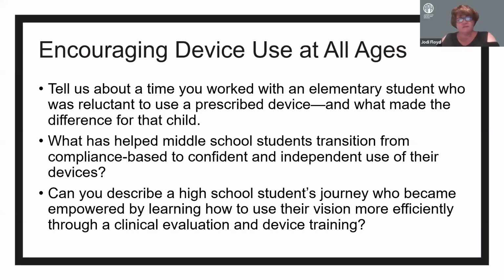So one of the things we did was what I call going through the side door, using things the student could use at school where the device would look like anybody else's. For instance, we gave her textbooks on audio with Learning Ally. Now you can use an iPad, or the app can be downloaded to your phone, and the student looks like anybody else with their phone or iPad, or you can even download it on a computer now.